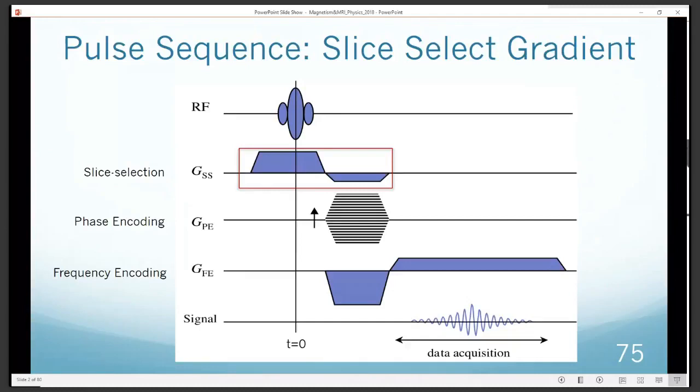I want to wind down here just talking a little bit. I mentioned pulse sequences before, and I've alluded to how these gradients and RF pulses have to be turned on in a specific order in a specific manner. And this is defined by our pulse sequence diagram here. It typically has 5 lines: radio frequency excitation line, which shows the radio frequency pulses, and then a line for each of the gradients we use, and then the signal reception line at the bottom.